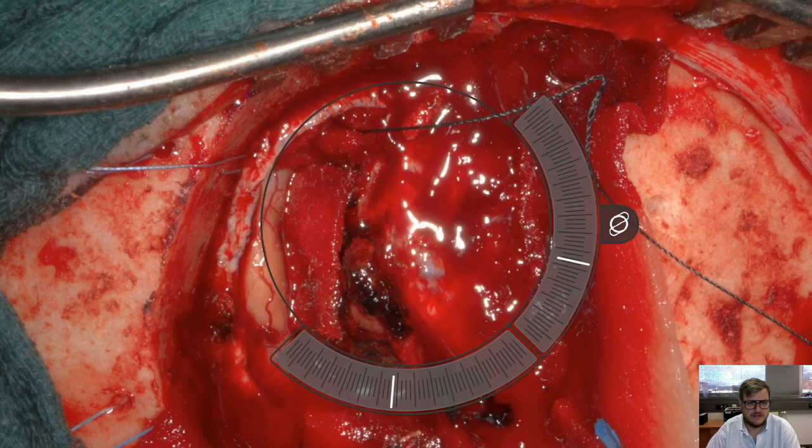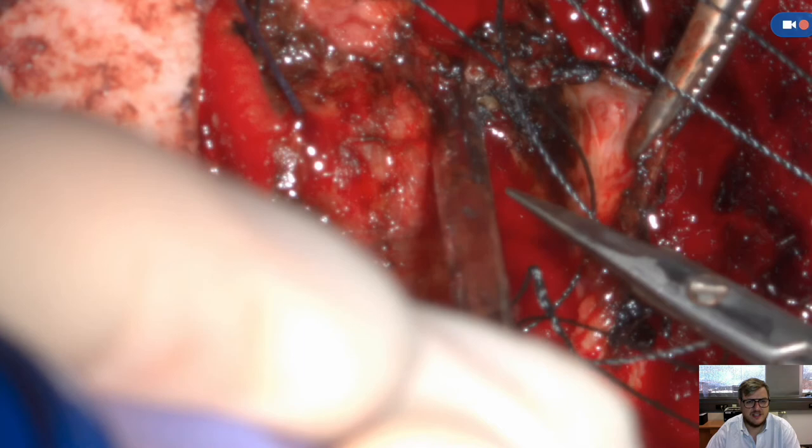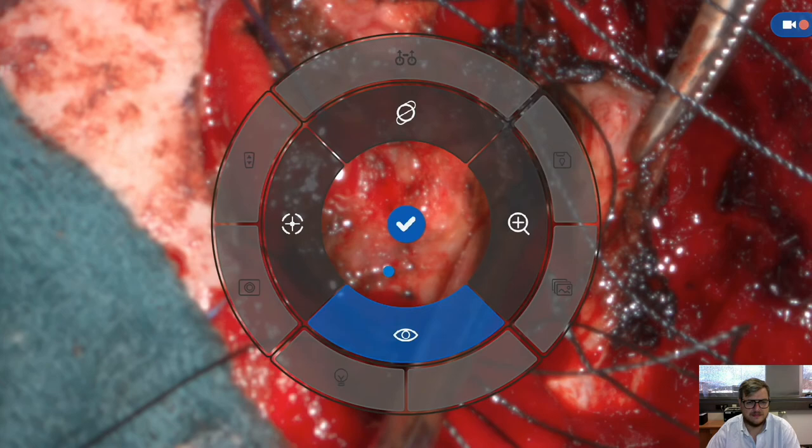In the beginning you see that the movements are very subtle and they get quicker over time. You see the detachment from the dura and the falx. Again the repositioning at this point of the surgery comes very easy and quick.